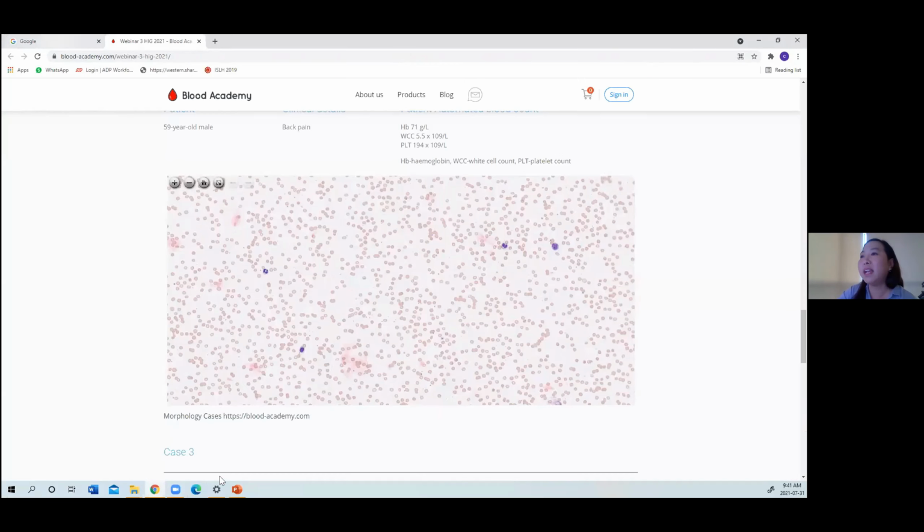So that can happen in abnormal paraproteinemia, like in myeloma, but it can also happen in a reactive cause, like in infection or inflammatory cause, where you have increased fibrinogen, increased polyclonal proteins that can also cause this picture. But you have to evaluate the patient for abnormal paraprotein if you see rouleau formations. Okay, so this is actually a case of plasma cell myeloma.